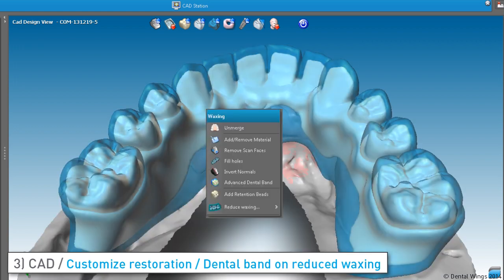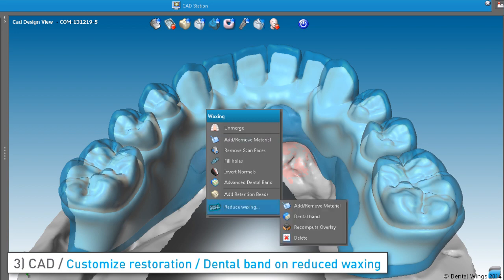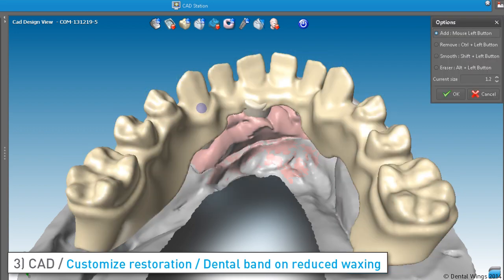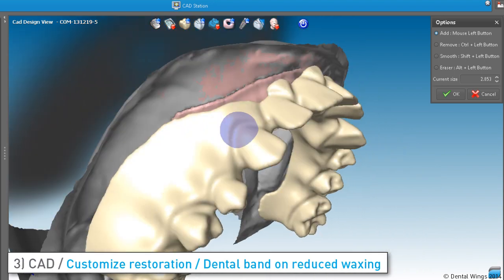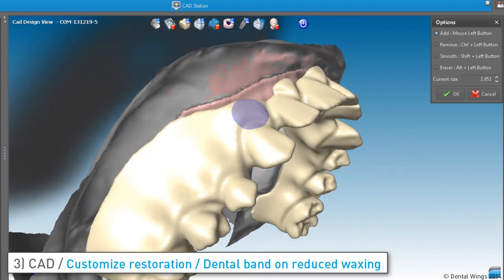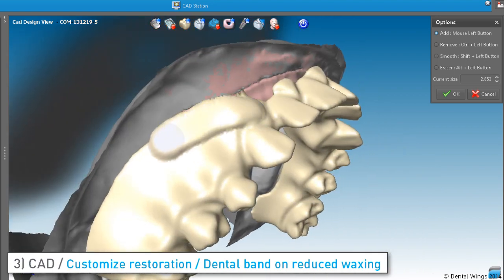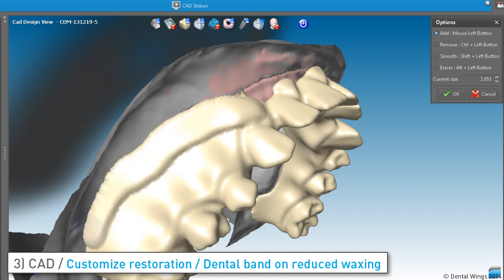Here are a few examples of what you can do with a reduced waxing: create a dental band, which adds the required thickness of material to project the overlay onto the anatomy. You can also add retention beads.